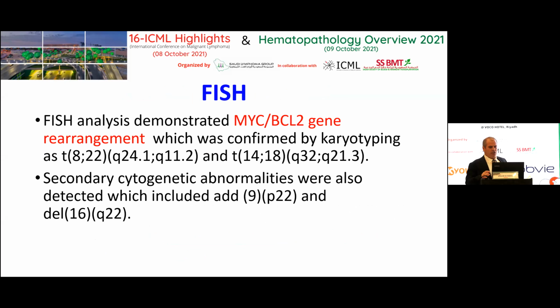We have to do FISH. Again, in such a case, we have to do FISH. Now, how is it reported? In the next slide, I will show how to report, because sometimes the FISH and the molecular study are not available on time to give a final diagnosis.